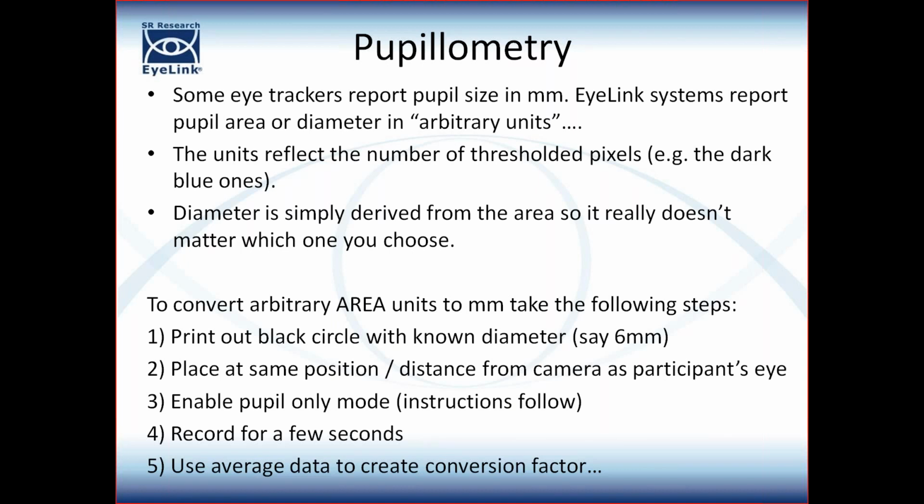All that matters is that you print out a circle somewhere within the range of, say, 3 to 8 millimeters, and you know its measurement. In other words, once it's printed, you can measure its diameter, and then you know that diameter.